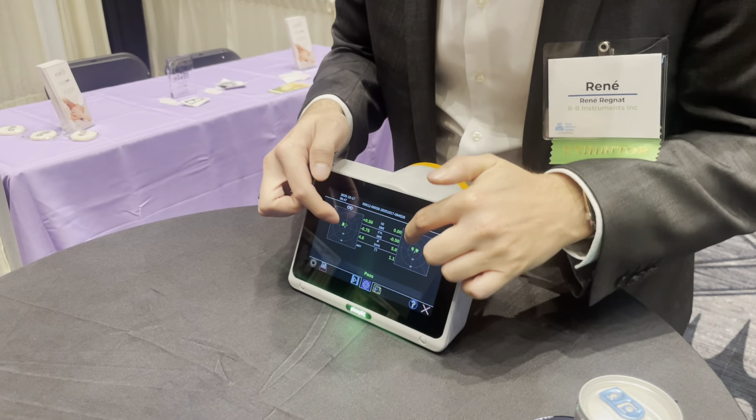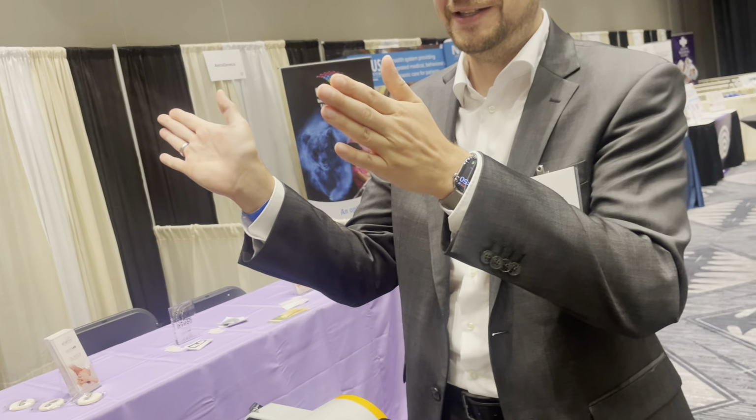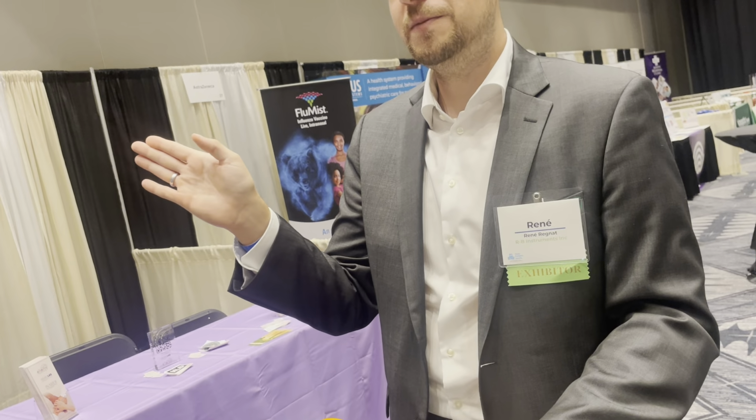Okay. Does a red dot mean anything? So, and we can also do that so you see it. Red dots, for example, mean, let's assume we have a child that has strabismus. One eye looks at me, one eye looks here. You will see a lot of red dots, which means we detect where the child looks at, but we don't calculate the refraction for that eye because that would be the periphery of the retina. So we wouldn't measure what the child actually sees. We would measure the refraction of what, when I look at you, what I see here, which is just blurry.